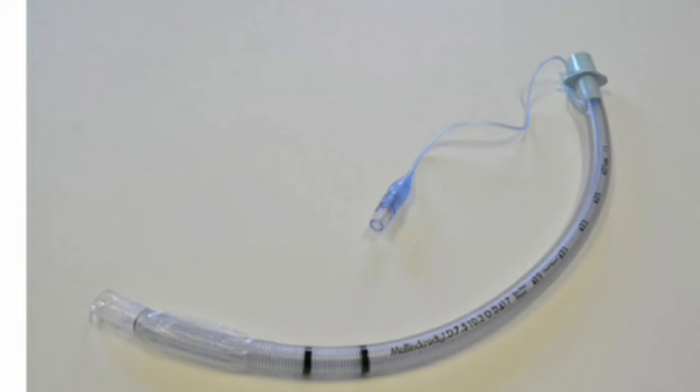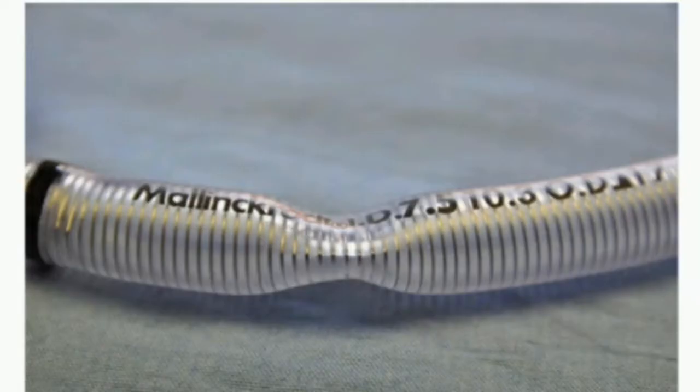Although armored tubes are less likely to occlude through bending because of the wire coil reinforcement, they are not a substitute for a bite block. While it is significantly more difficult for a patient to totally occlude an armored tube compared to a regular tube by biting onto it, the armored tube has the disadvantage of having a memory, meaning it won't expand back to a round diameter once the bite is released, significantly increasing resistance to airflow.